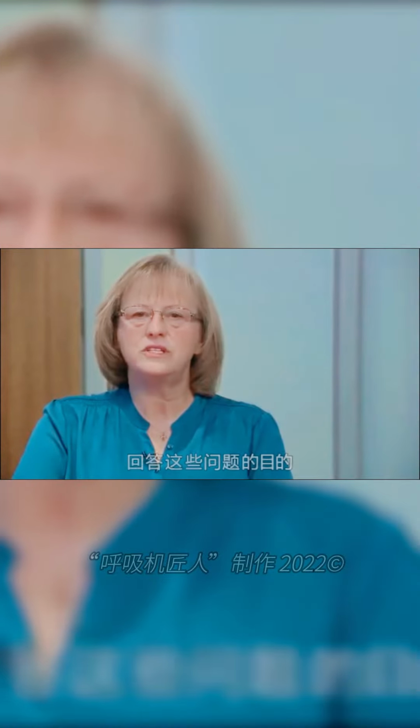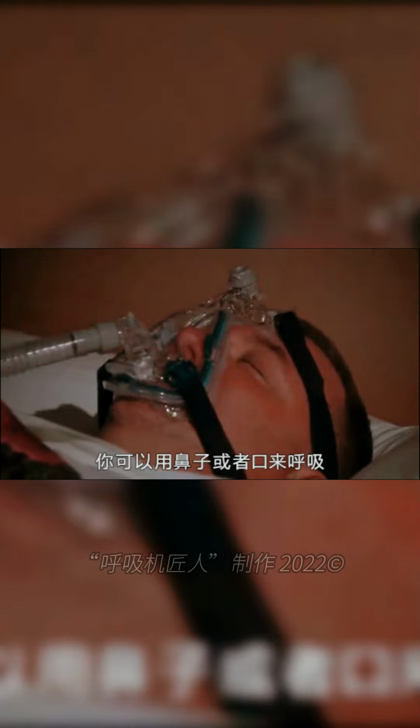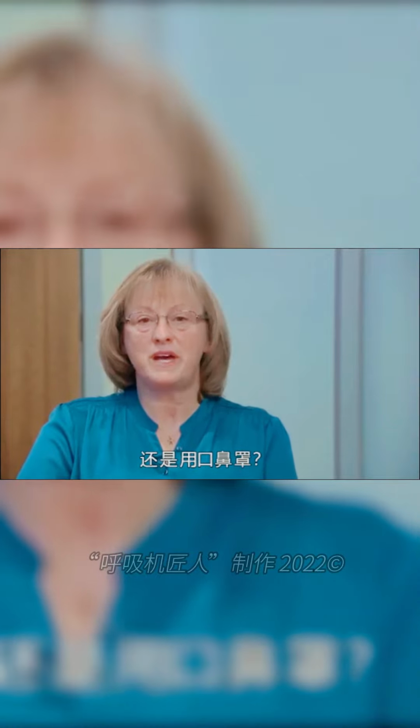The answers to these questions will help you and your respiratory therapist select the best PAP mask. To use a nasal mask, you must be able to breathe clearly through your nose and keep your mouth closed during sleep. The full face mask allows you to breathe through both your nose and your mouth. Your first decision is, can I use the nasal mask or do I need a full face mask?